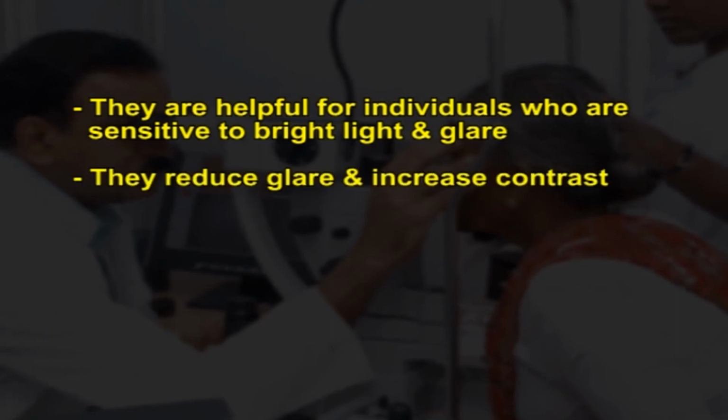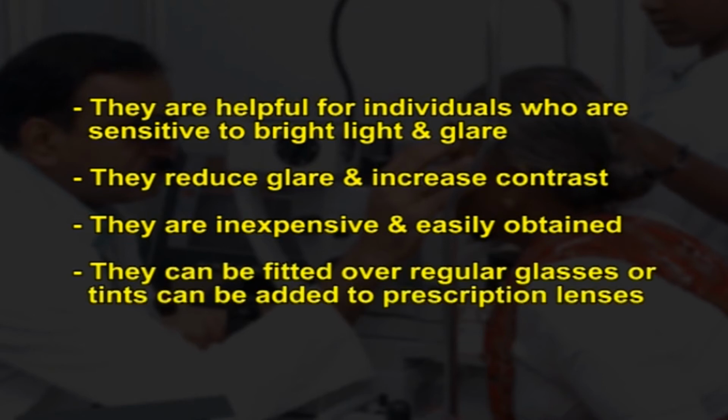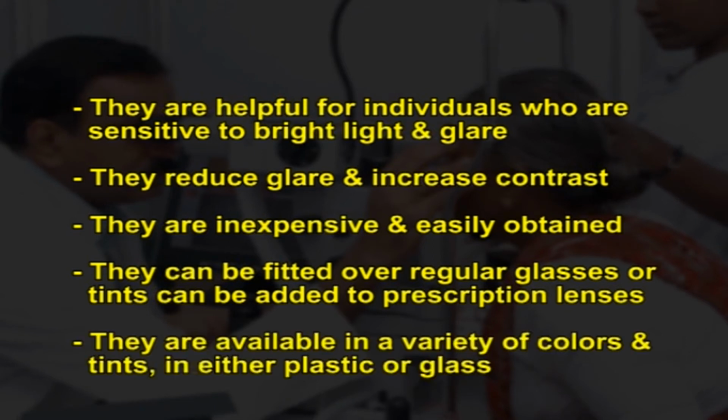They reduce glare and increase contrast. They are inexpensive and easily obtained. They can be fitted over regular glasses or tints can be added to prescription lenses. They are available in a variety of colors and tints in either plastic or glass.